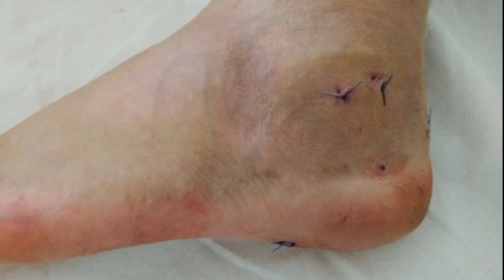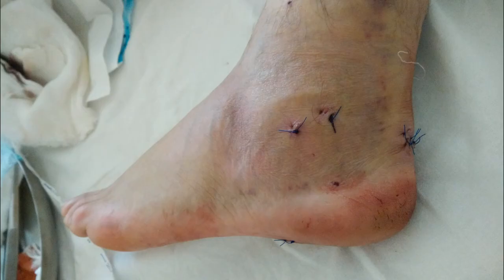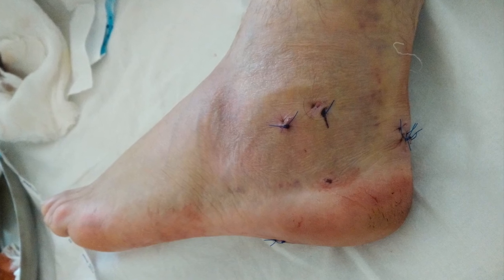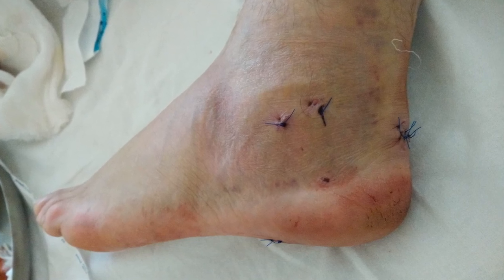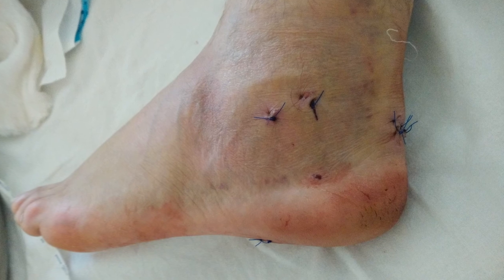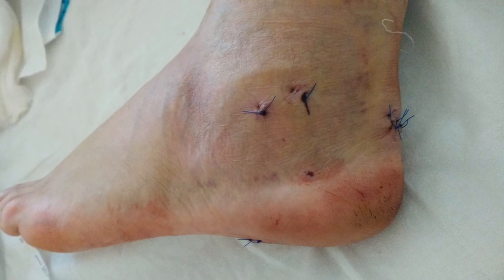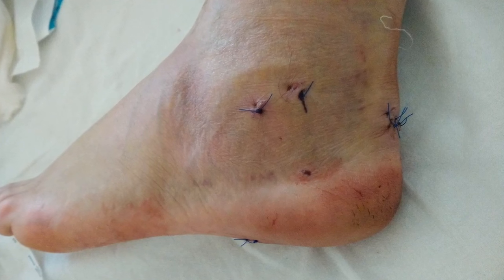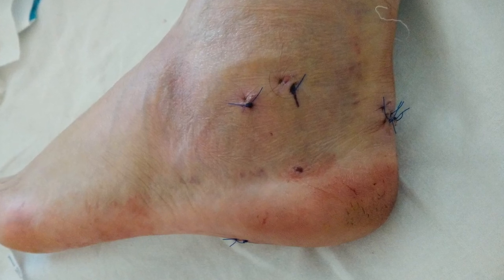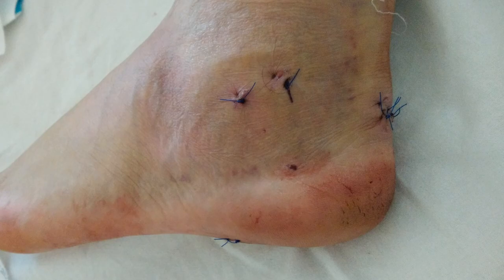In this regard, in cases of unclear C-arm pictures or unsuccessful attempts to improve the position of fragments, I recommend to continue the reduction process through the sinus-tarsi approach. My own experience showed that stubborn maintaining of the percutaneous approach leads to long surgery and failed reduction.